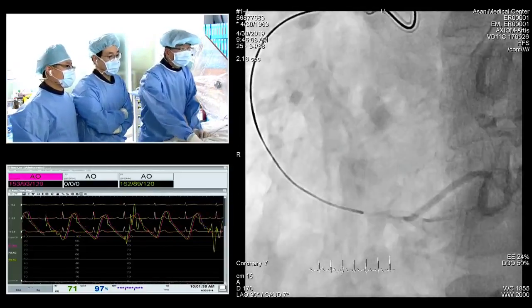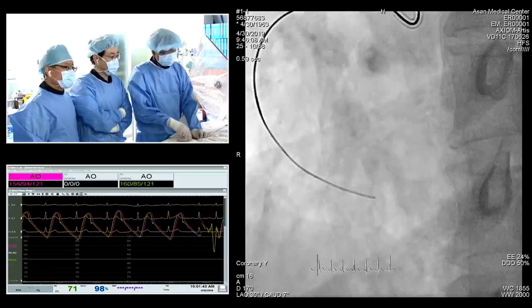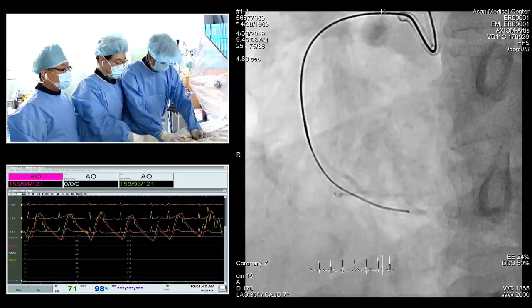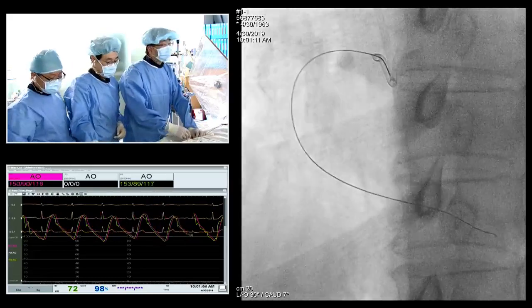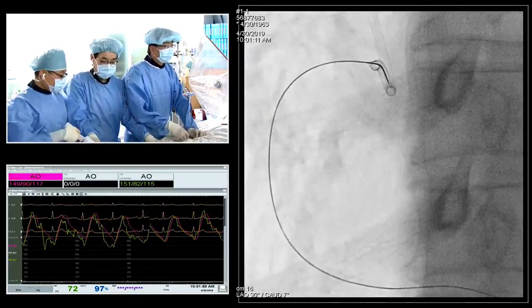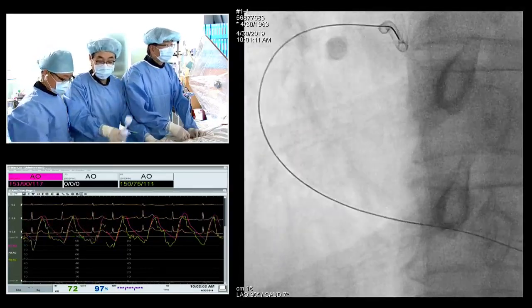Could you give me some comment on our procedure? So secure the distal wire, and once the catheter cannot pass, you have to start from the thinnest and the smallest balloon. Yeah, to achieve this, the 1.0 balloon. Yes, start from the smallest. And then you can do the wire exchange to the soft one and finish the further procedure. Okay.